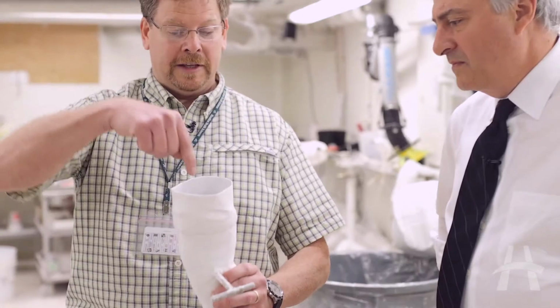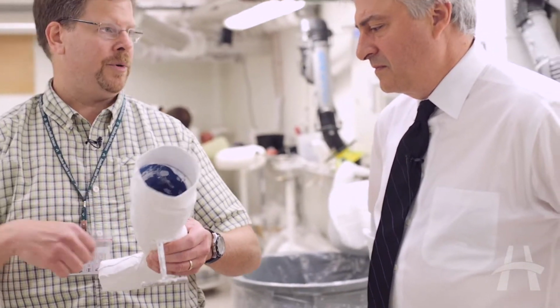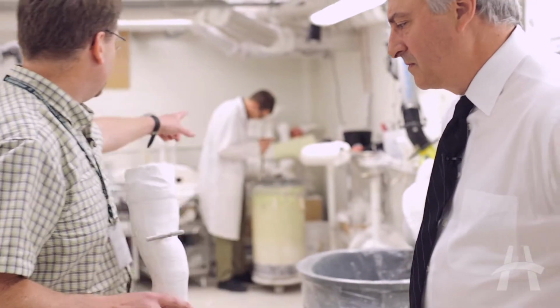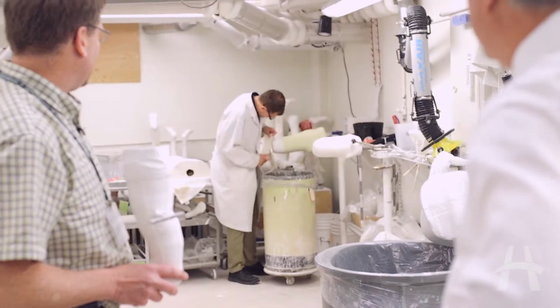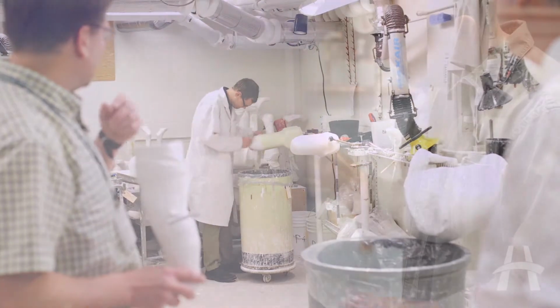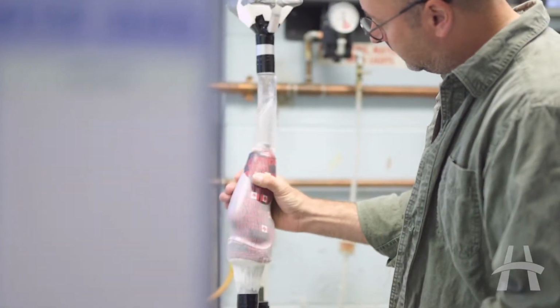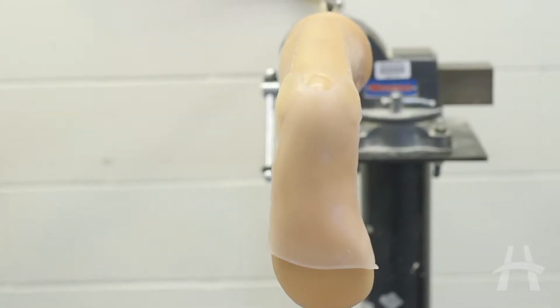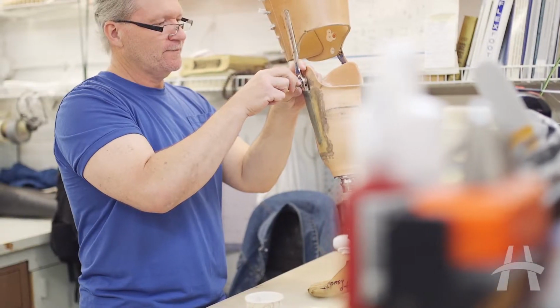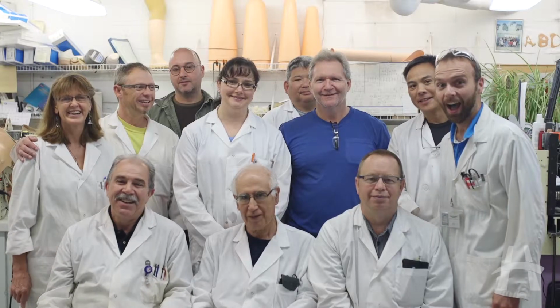So the beginning of the process is we would start by filling this up with plaster and creating a solid core on which we would make some modifications. And right now Todd is making some plaster modifications on another kind of mold based on the biomechanics of the situation as it presents. We'll come up with some sort of mold that makes the best sense, choose materials, and then from that point the technicians take over and they're the experts in implementing the plan.